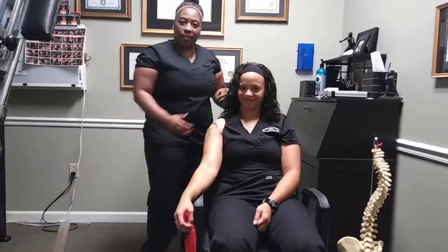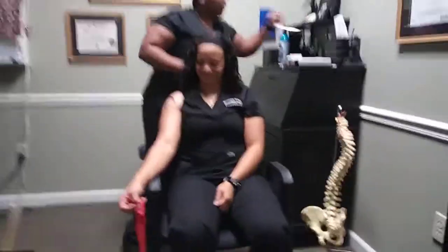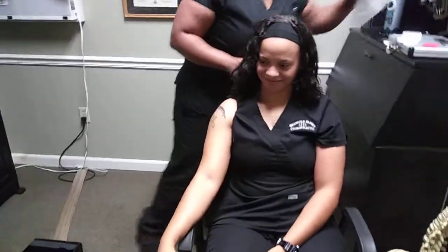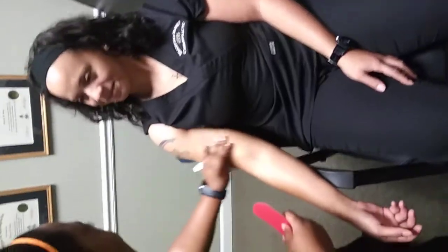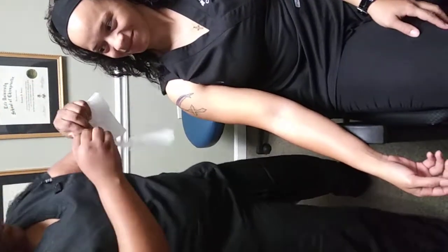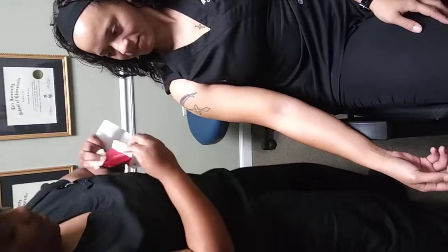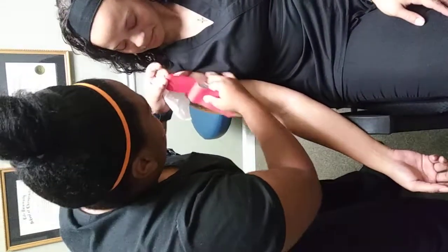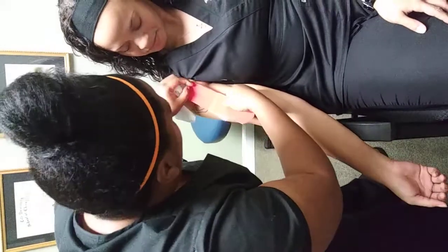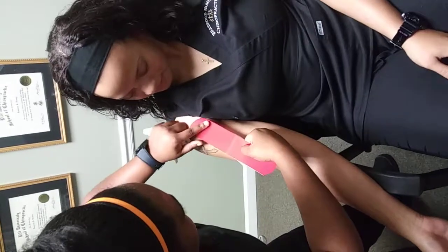Now we're going to do some taping for the Bicipital Tendinitis. This is rock tape. We're going to get in here and place it right over that biceps tendon, where it attaches.